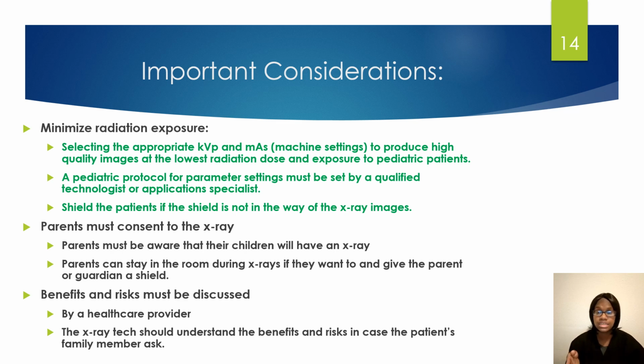If you work at a facility where you do not routinely perform x-rays or CT scans on pediatric patients, make sure that there is a protocol in place, especially whenever kids come in. There is a protocol and parameters set for that child, and you are not exposing them to radiation that adults may get. So it is very important to check your KVP and mAs, especially if you are imaging, let's say, adults, and then a pediatric patient comes in.